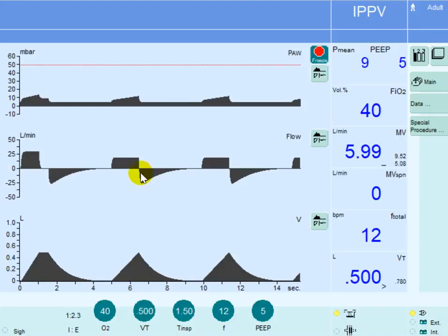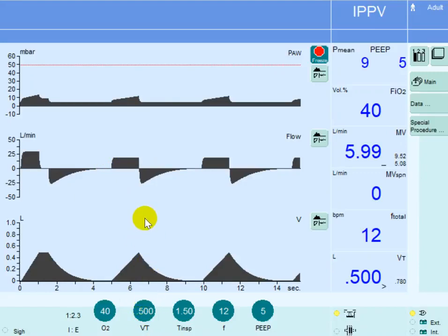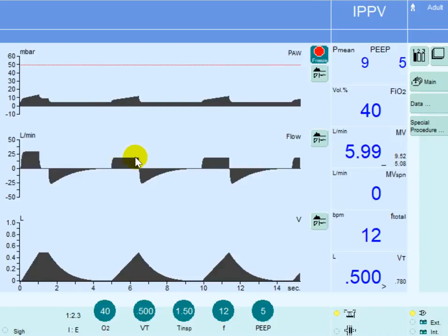That's why the plateau time is eliminated completely. We don't see plateau time anymore because we are utilizing the whole inspiratory time to deliver that 500ml at a rate of 20 liters per minute. Decreasing the flow rate will decrease the airway pressure — notice the airway pressure is decreased compared to the previous one. According to the same equation of motion, the lower the flow, the lower the pressure required to get that volume in, and it will decrease or maybe eliminate the plateau time completely.